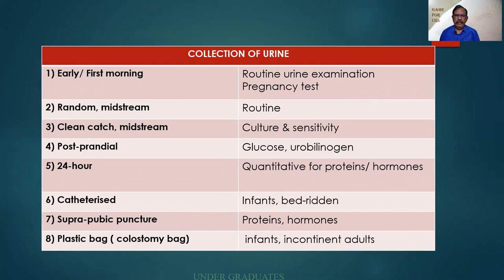Collection of urine. Students have a tendency to go directly to the Benedict solution or the protein test. But they should realize that marks are being allotted for the physical examination, coming to a diagnosis, performing the clinical experiment, as well as answering the questions the examiner asks.